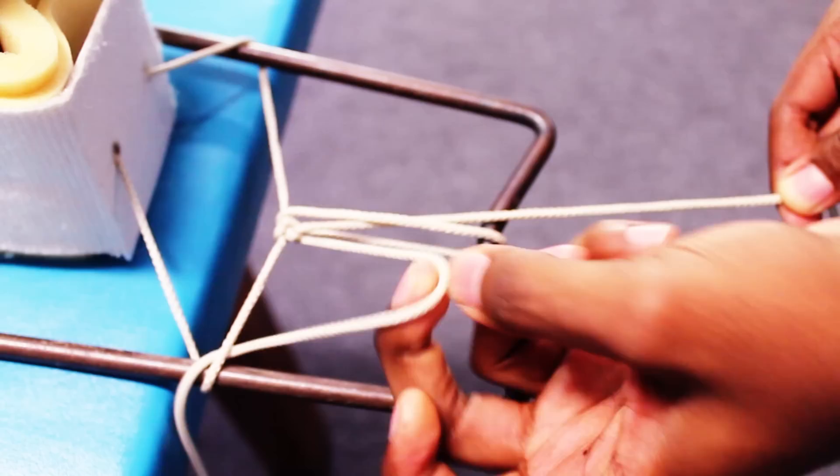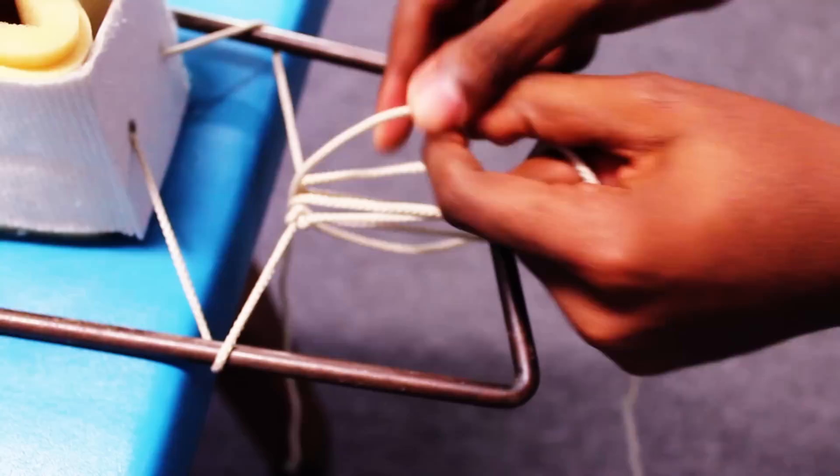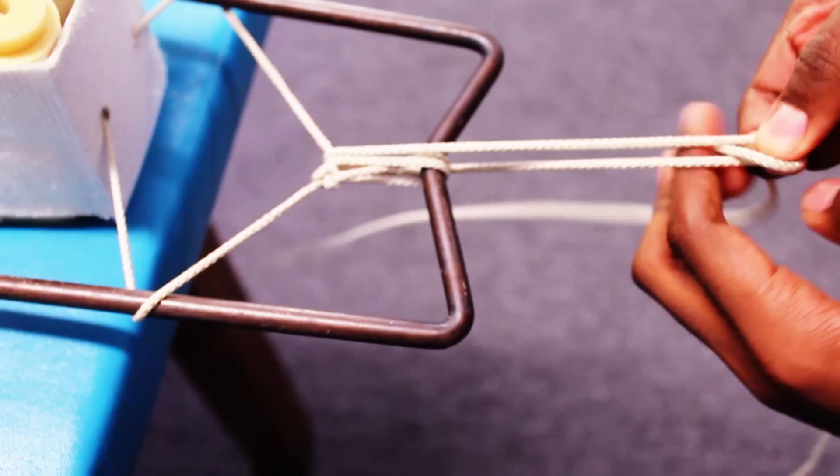Next, you want to create a pulley system that allows you to either increase or decrease traction according to what's best for your patient. You can secure the pulley in any regular knot.